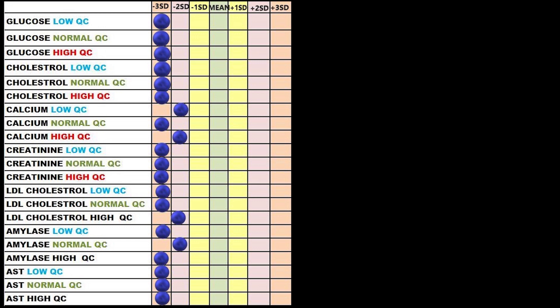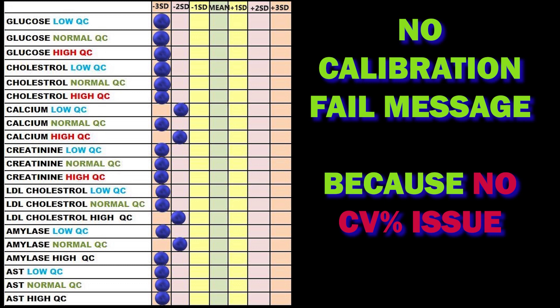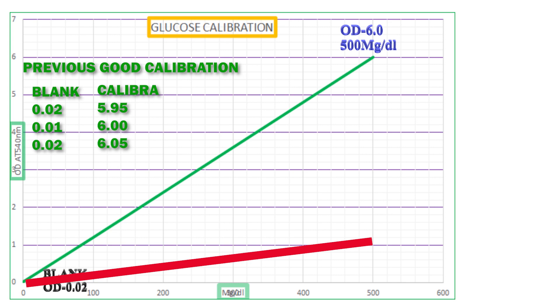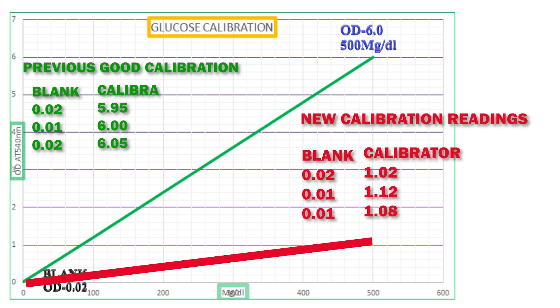Not all calibration failures give obvious calibration issues — many times QC fails due to improper calibration that we need to fix. You can compare the previous good calibration curve reading with the new one. For example, if the blank reads 0.02, 0.01, and 0.01, the precision looks good. But if the new calibration values are 1.02, 1.12, and 1.08, the precision also looks good.